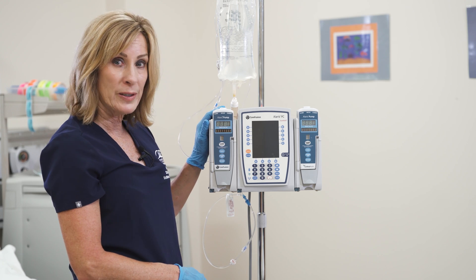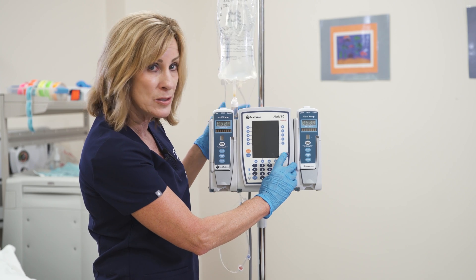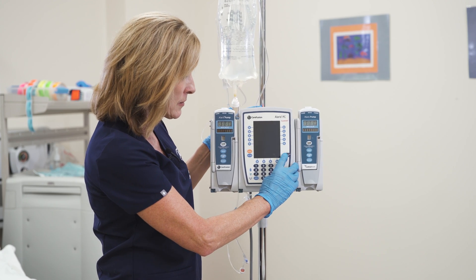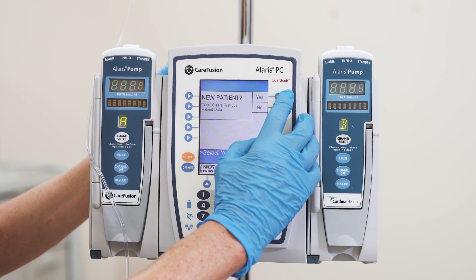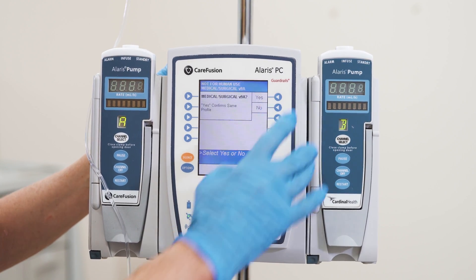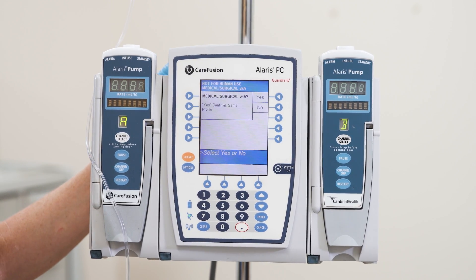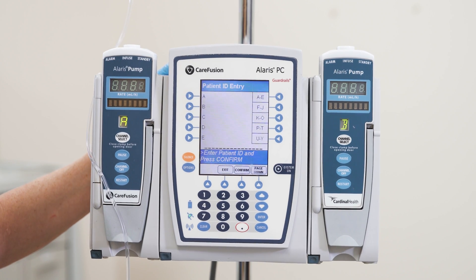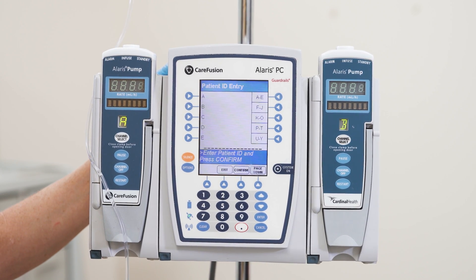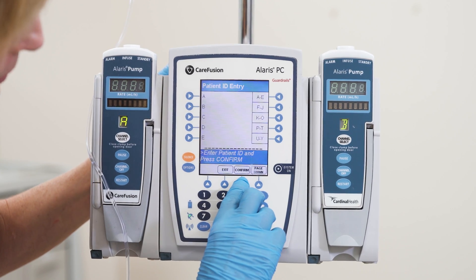Now we're ready to go over to our Laris pump and turn it on. We're going to turn it on down in the corner where it says system on and press the button. It's going to ask us if this is a new patient — we'll say yes. It's going to ask if this is a med-surge patient — today we're pretending it is, so yes. Now it's asking for my patient ID number, so I would enter that and press confirm at the bottom.